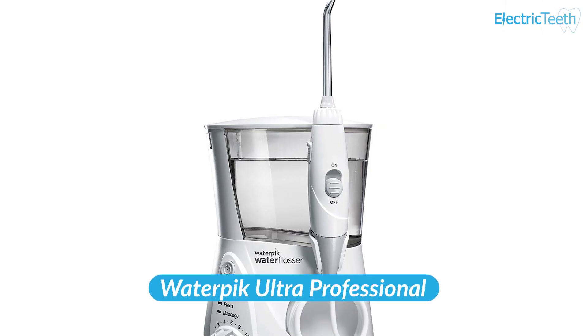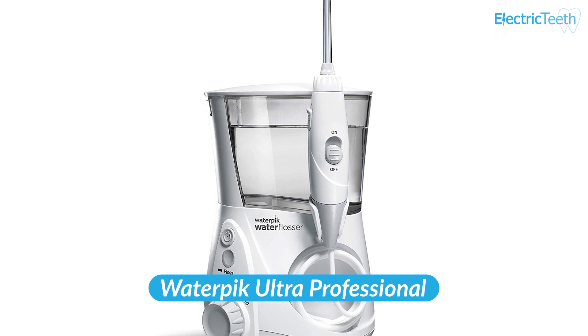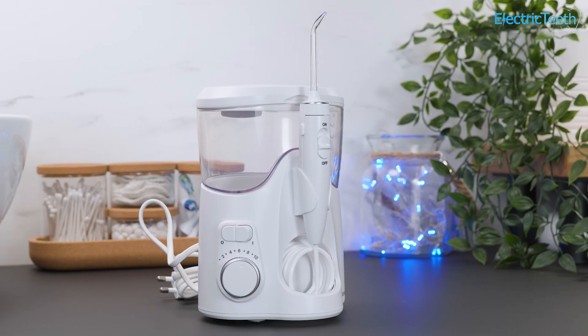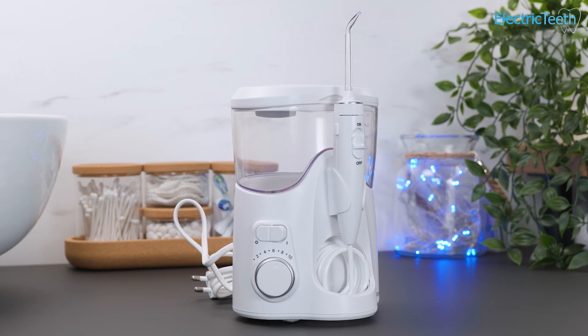But my pick would be the Waterpik Ultra Professional. It has a few more features and is actually more cost effective. So let's take a look at the main pros and cons of the Waterpik Ultra Plus, starting with the pros.